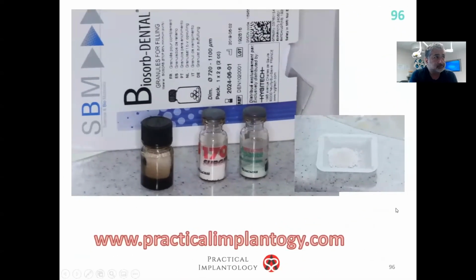Here I used a combination of, it's not Ethos. Ethos is a beautiful material, but I'm using this quite a lot now. We actually sell it, so it's good for us to use it, and we're getting good results with it. So it's a combination. We didn't use this non-resorbable hydroxyapatite. We used this beta-tricalcium phosphate, and we mixed it with medical grade calcium sulfate to create a mix. Usually I mix it 50-50.